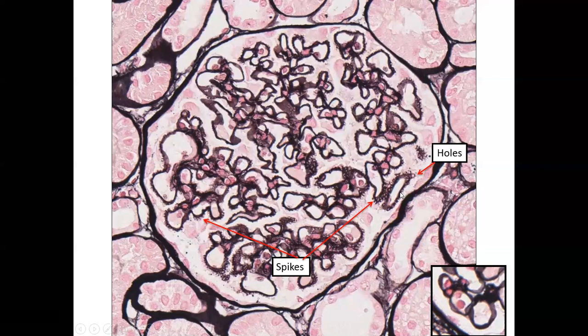So the endothelial cells are probably happy and healthy. They're probably not upset at all. And these immune deposits are all right below the podocyte. Podocytes don't like being in contact with immune complexes, and so they start to lay down new GBM. I like to think about it as if they're trying to wall themselves off from the immune deposit.